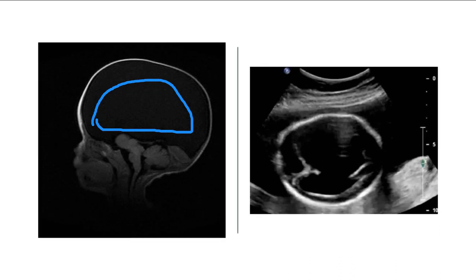So don't be confused if you get a picture of this on your registry. Look for your context clues. Look at what the question is asking you. These pictures may look the same on ultrasound, but you need to look at what other information they're giving you.